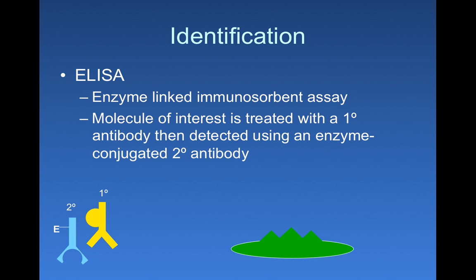It's also sort of the basis for a majority of the hospital laboratory tests that detect proteins. There's some sort of ELISA variation or ELISA itself. Also, you find a bunch of ELISA tests for home use assays, stuff you would pick up in Walgreens or CVS to detect particular diseases.